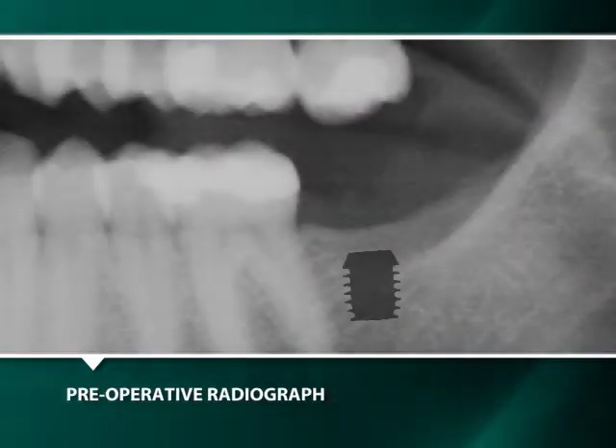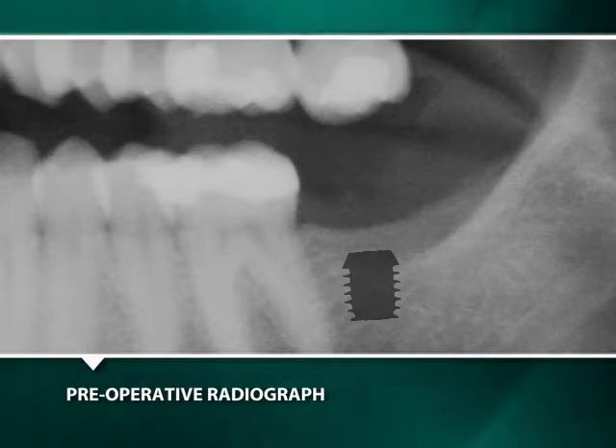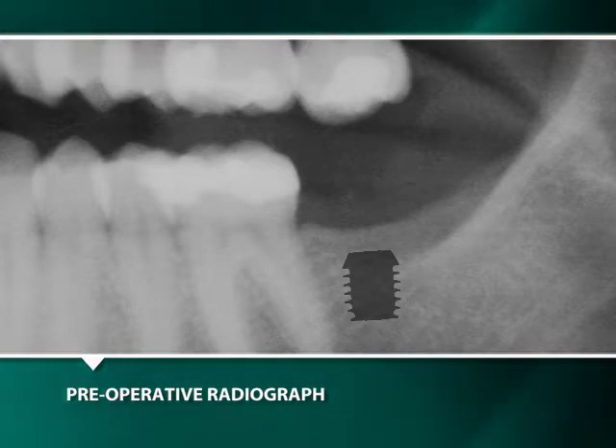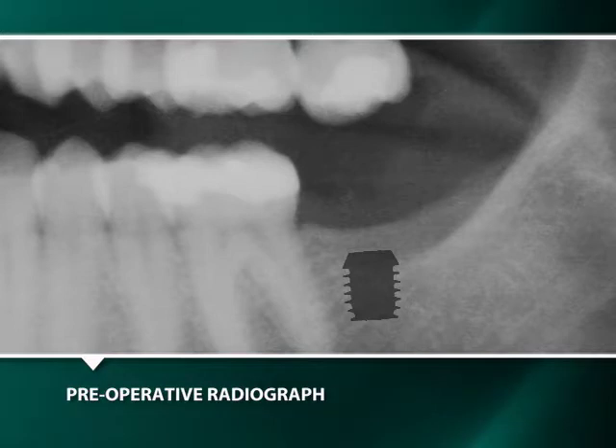This video will demonstrate the two-stage surgical placement of a Bikon 5 x 6 mm ultrashort implant for a mandibular left second molar area and its restoration with an integrated abutment crown. Our demonstration begins with a clinical and radiographic examination.